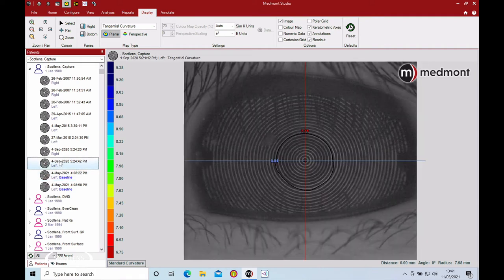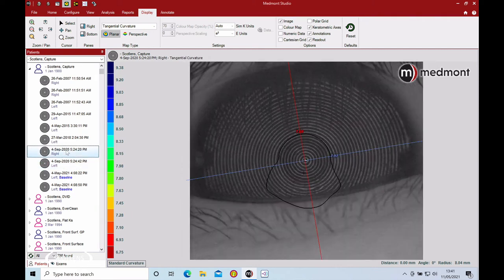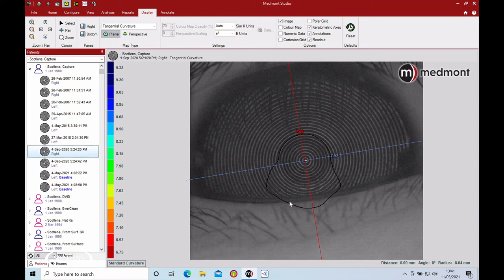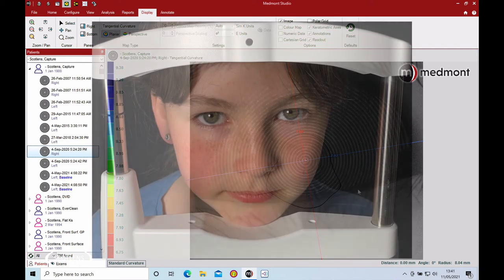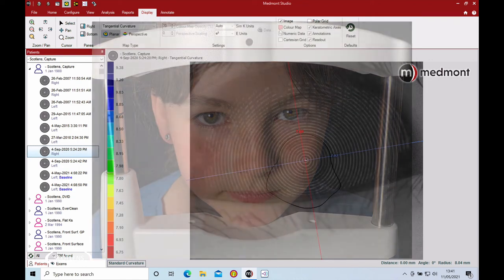This patient has a bit of top and lower lid interference, and this is even worse for the lower lid interference. When you've got lower lid interference, you want to try and get the patient to put their chin back and tip their forehead forward, and again, open both eyes wide.